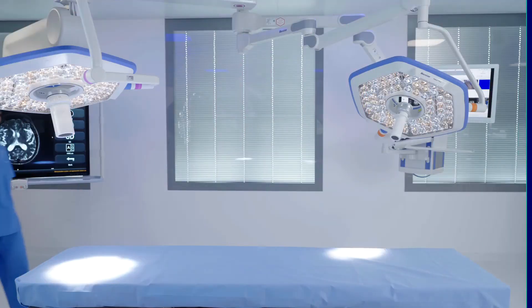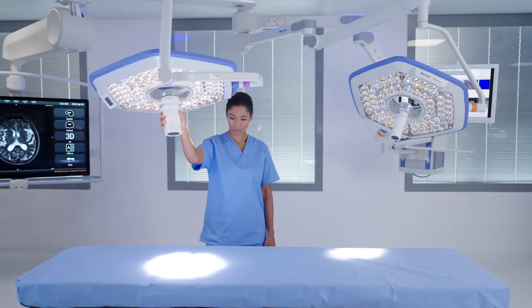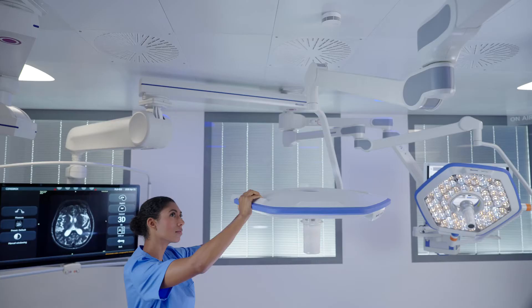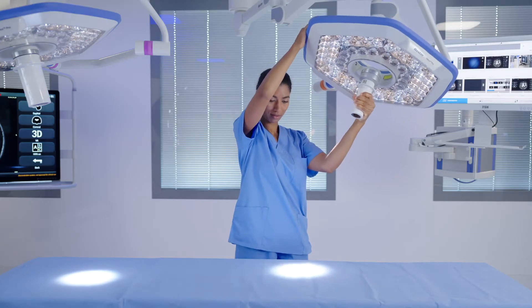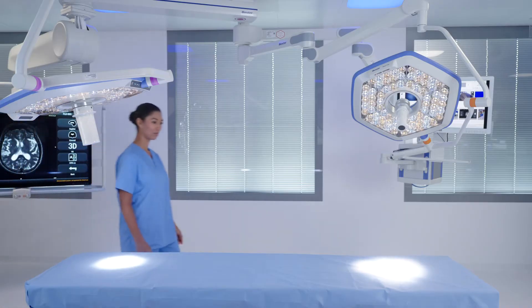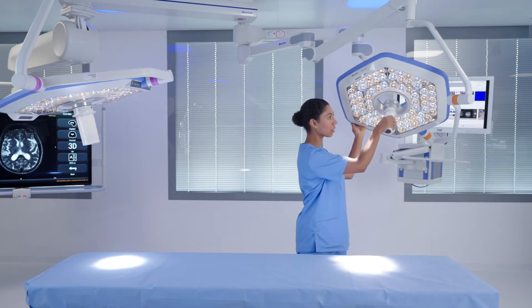To adjust the Helix Pro Surgical Light, grasp the sterile light handle in the center of the light head or the non-sterile handles on the light head and ease the light in the direction you would like it to move. Continuous motion joints on both the light head and arms allow full range of motion without stops. For ease of movement when adjusting the lights, we recommend keeping a slight bend in the arms.